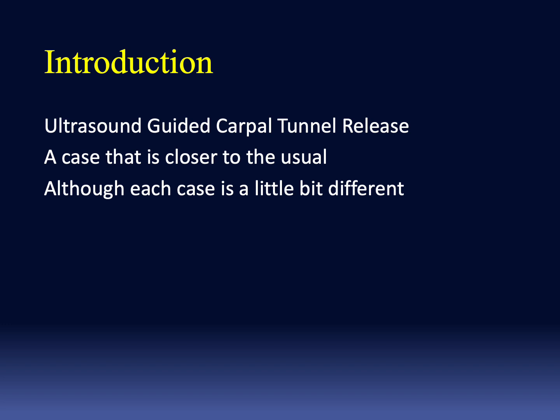Introduction. This case is a more typical ultrasound-guided carpal tunnel release, although each case that we do is a little bit different.